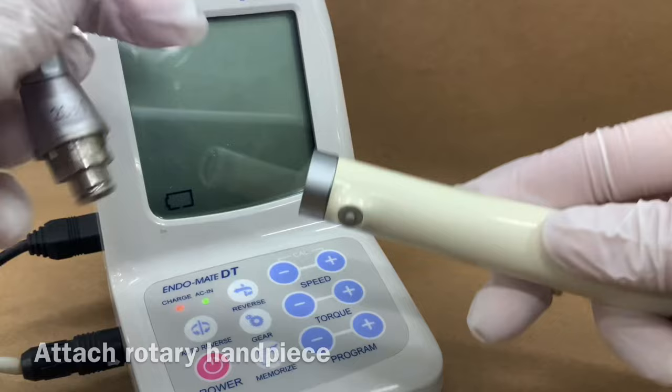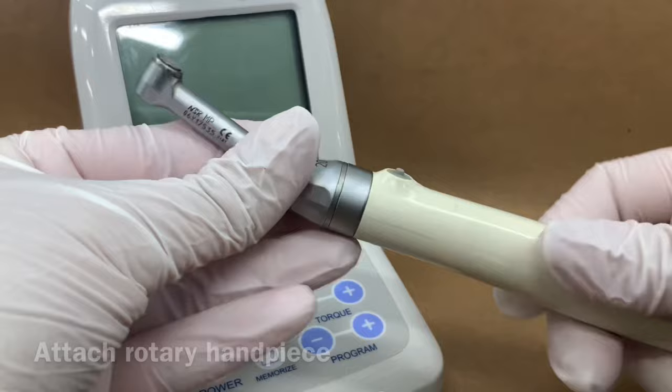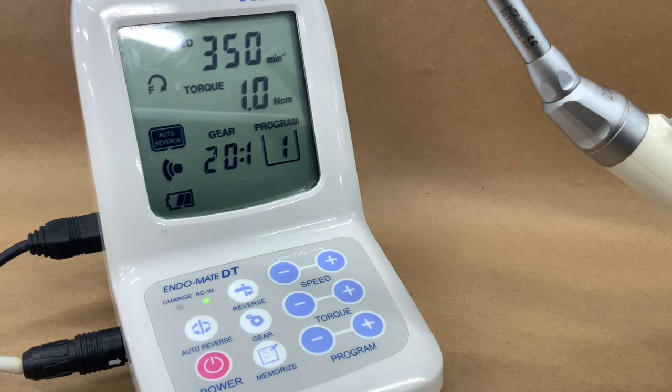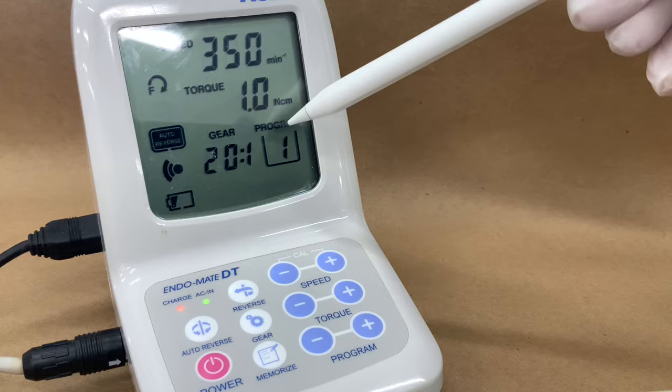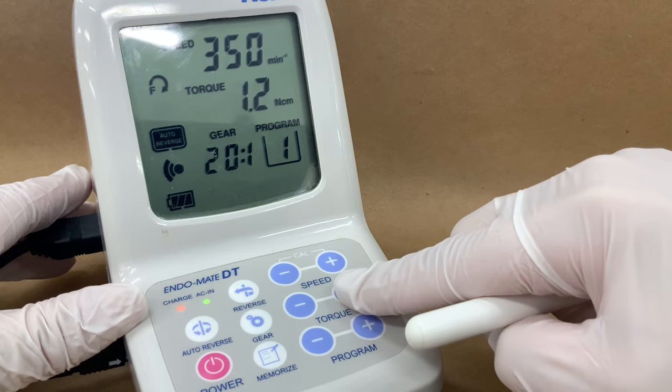The rotary handpiece must be attached to the handle. It can be attached in different positions with respect to the push button, depending on the angle that you need. To turn the unit on, hold down the power button. Look at the settings displayed on the screen, including speed and torque. These can be adjusted using the plus and minus buttons.